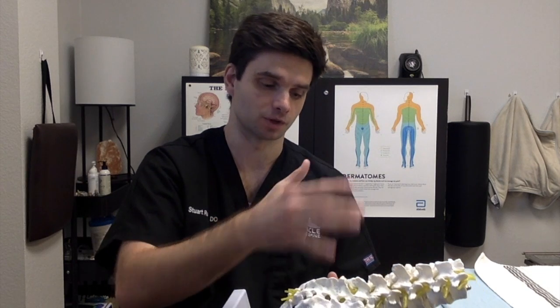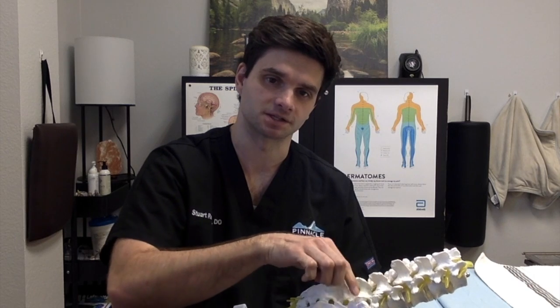By applying electrical stimulation over the processing center of those cells from those damaged nerves in the groin, we can modulate the way those signals are sent and improve that pain without causing any sort of noticeable sensation to the patient. The way that dorsal root ganglion stimulation leads are placed is through a minimally invasive procedure, through a live x-ray, initially using needles to access the spinal space, and then passing the electrical leads under image guidance right over to where the cell bodies of those dorsal root ganglia are.